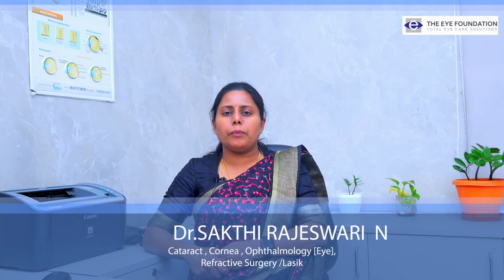Apart from these, not all patients can undergo LASIK. So what do we mean by that? Based on the refractive error of the patient, the corneal topography and the thickness of the cornea, we decide whether the patient can undergo LASIK. Some patients have a very high refractive power, like more than -7 or -8, or a borderline corneal thickness, and are not eligible candidates for LASIK, but they wish to get rid of glasses or contact lenses permanently. So we have an option for them, which is called ICL, or the implantable intraocular contact lenses.